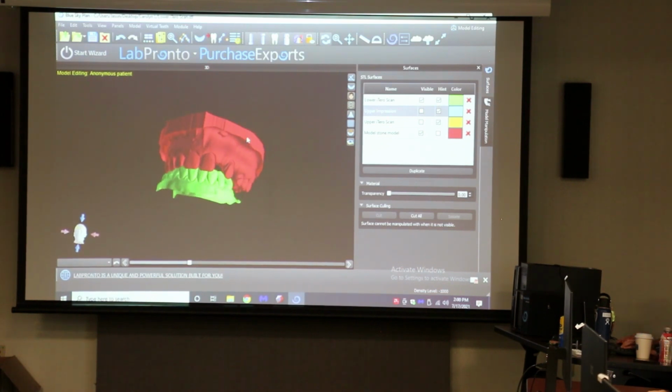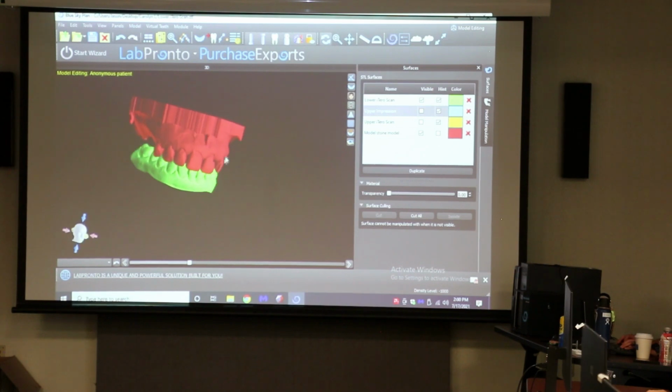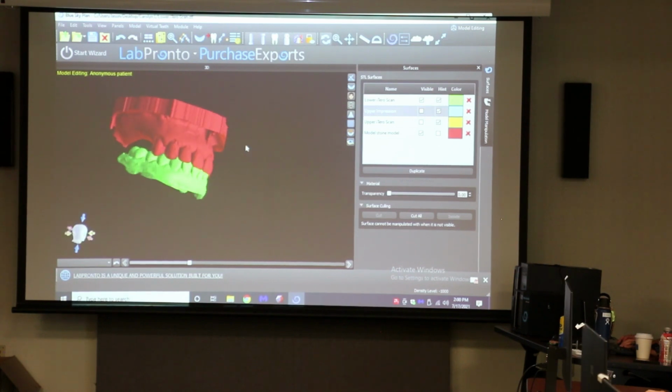You don't need to. It's just that's what you're used to looking at. You're not used to looking at the inverse relation, both sides of it on one sheet. Yep. It's strange to think of it like that.